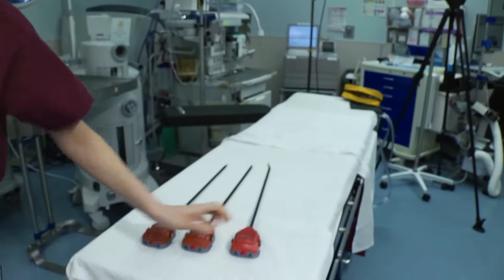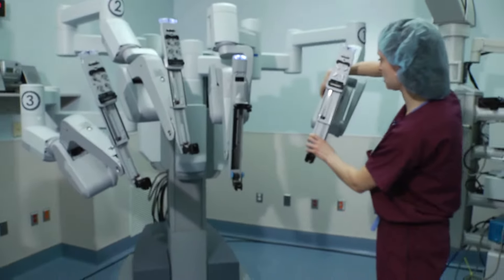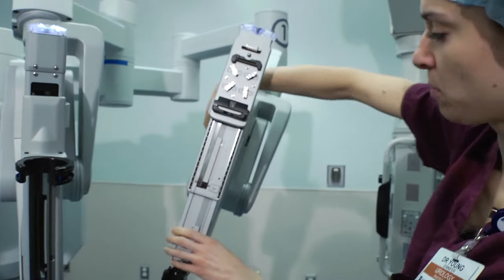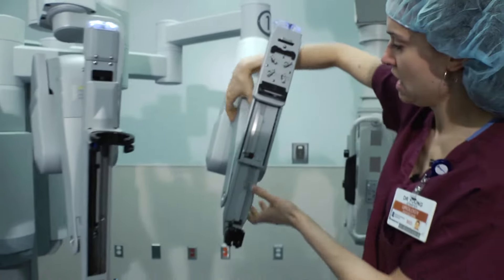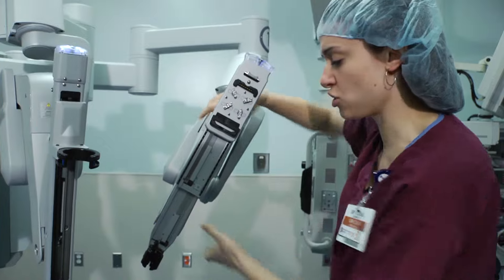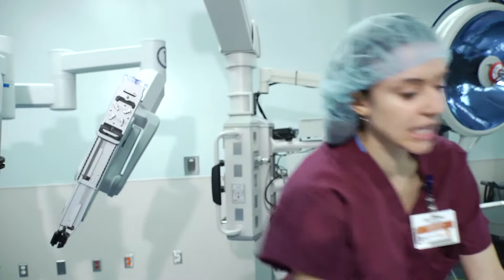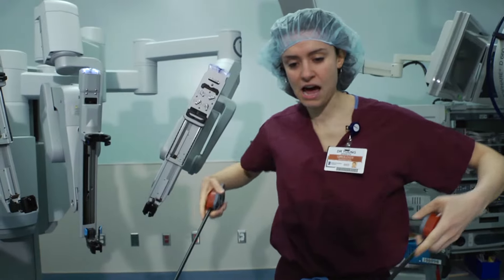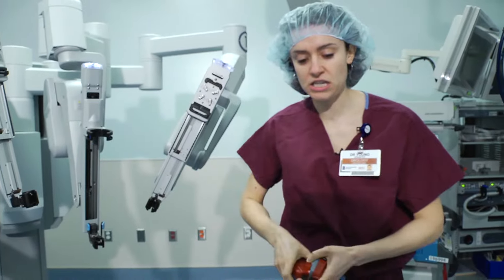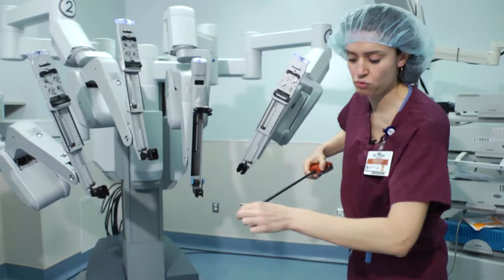The arms have so many dimensions of movement. We can move them like this — we've essentially got what we call a shoulder and then an elbow. The arms move like this, and they move side to side like this. That's another advantage of robotic surgery over laparoscopic or keyhole surgery. With laparoscopic instruments you hold them like this, with movement limited to in and out, twisting your wrist, and opening and closing. With the robot, you actually have a wrist — wristed motion.